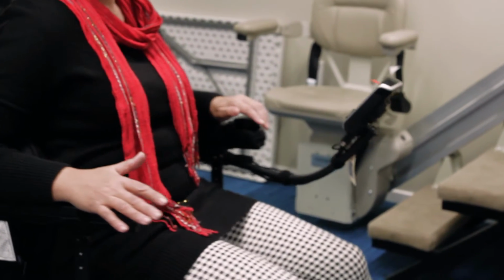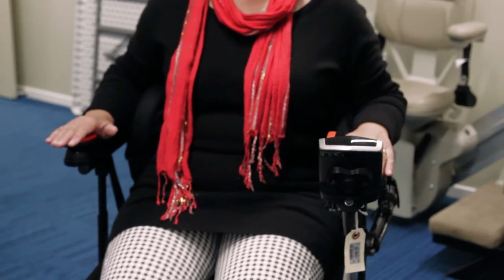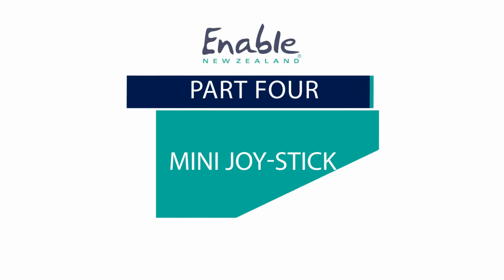So just thinking of how that chair might drive, and like I said, you typically see your proportional with your joystick. You can do it with proximity switches, which I'll come back to later. And non-proportional is that you hit a button and you move. So there's no acceleration other than what's programmed into the chair.